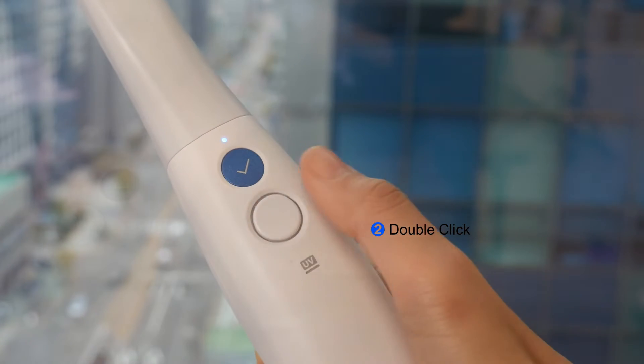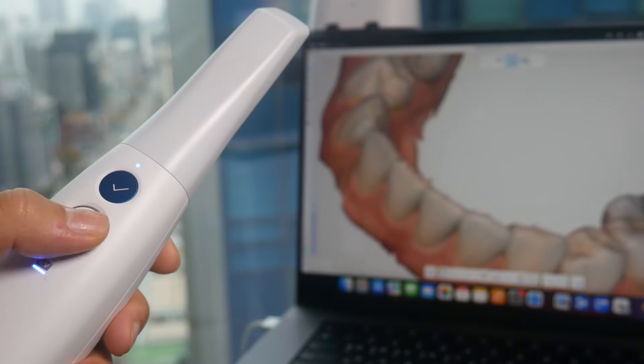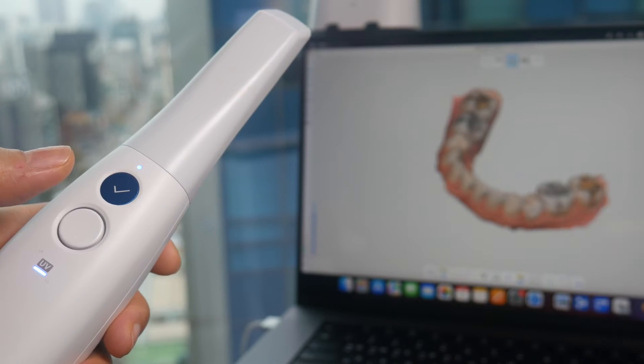Second, double-clicking the center of the control button places the scanned data in the center of the screen.